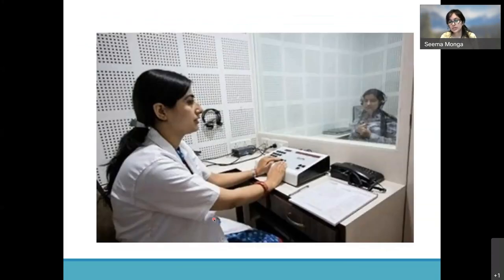So where is pure tone audiometry done? It is done in a soundproof room, right? It is done in a soundproof room. The sound pressure level of the noise in the room should be less than 25, 26 decibels, right? It is a soundproof room. This is the technician that is sitting here, and this is the patient, all right?